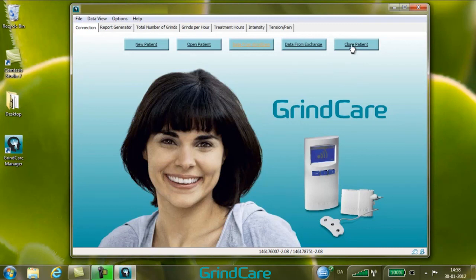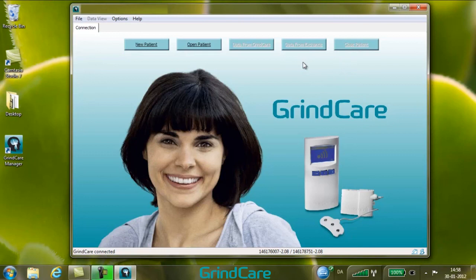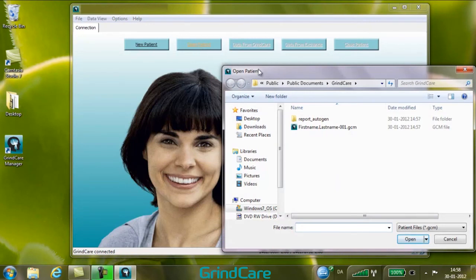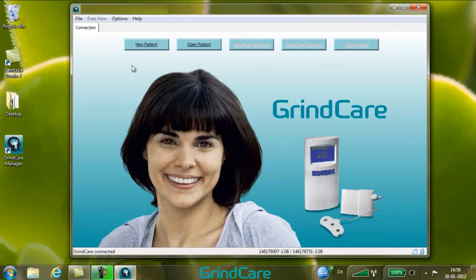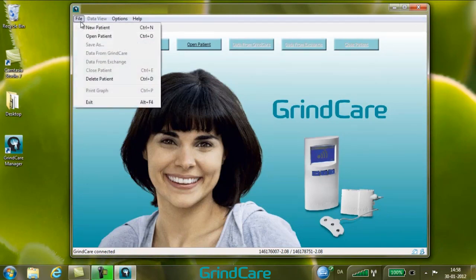To close the patient file, click Close Patient. To open an existing patient file, click Open Patient and select the desired patient file. You can now see that you have access to all the data and menus as described earlier. To close GrindCare Manager, close the patient file and select Exit in the file menu.